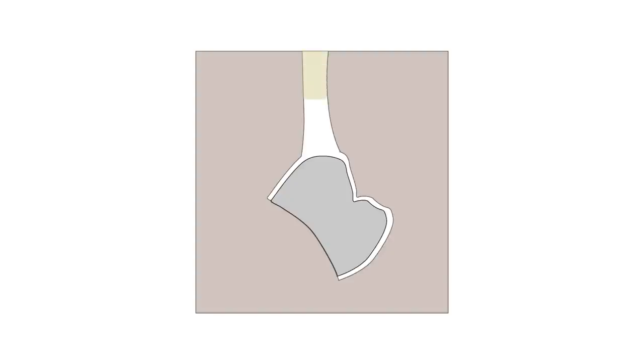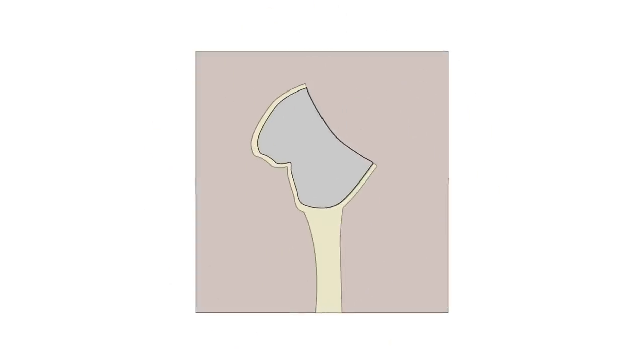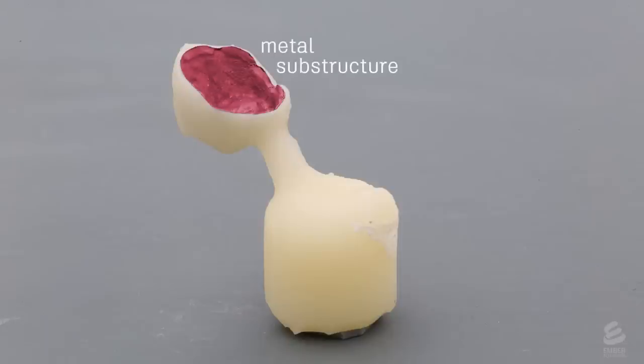A special ceramic is shot into the mold, filling the empty space. After cooling, the investment is removed. The metal substructure is now fused to the porcelain coating.